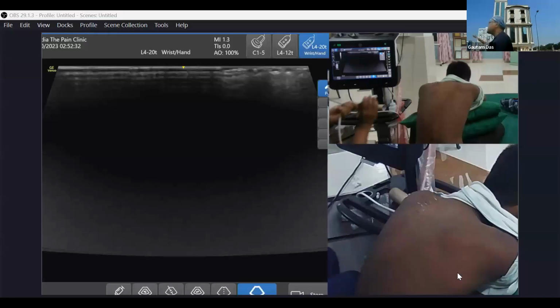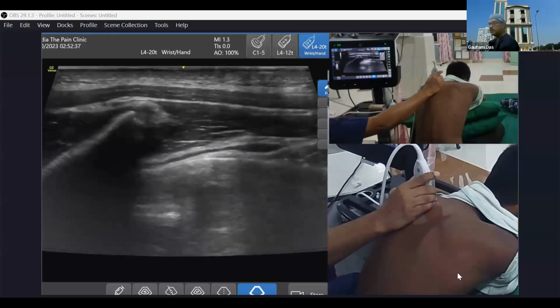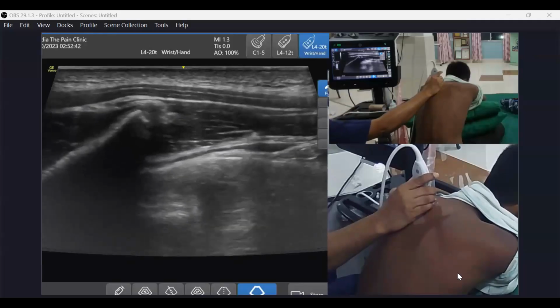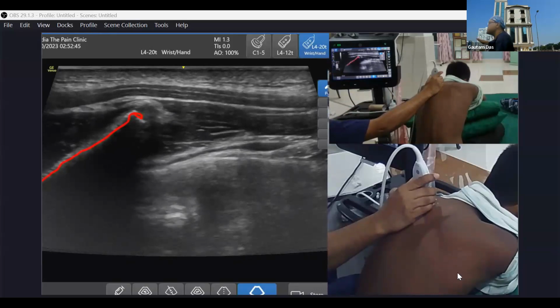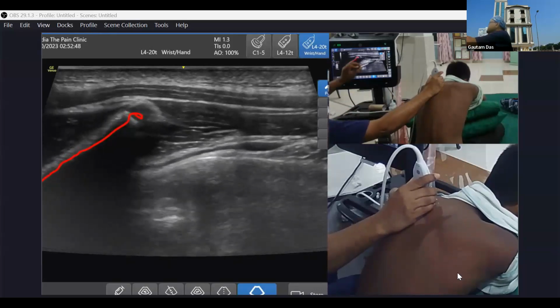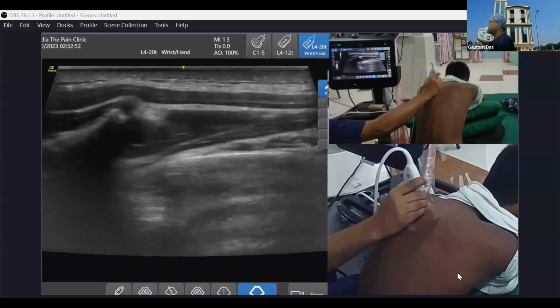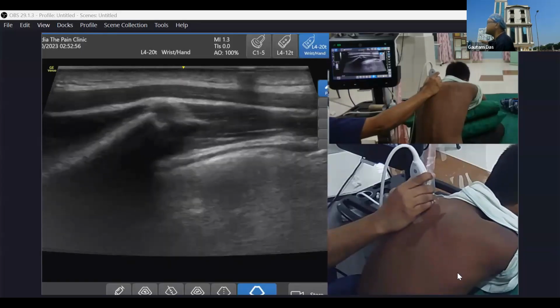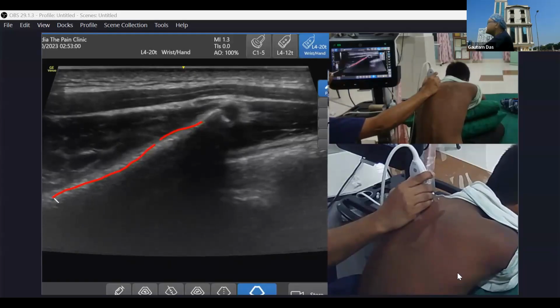So just now I was showing this picture. You just remember these things. Can you remember this picture? Just a little ahead, I was talking about this. Medially, this was the supraspinatus. Not the spine of the scapula. Over the spine of the scapula you cannot see the muscle. But here is your supraspinatus fossa. So now this is your supraspinatus, and the blade above the supraspinatus.